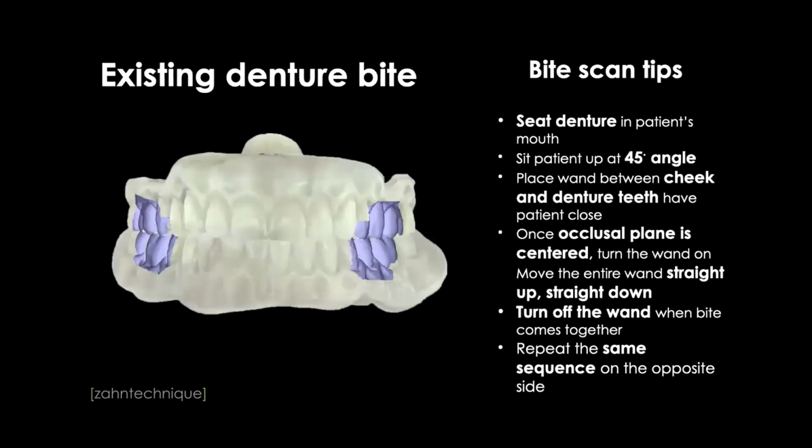So now, if you have a double arch denture, we can just take a bite and take it out like a sandwich and scan that, right? If you have just one arch, we put it in the mouth, let the patient bite and scan the bite in the mouth. So we have basically a bite to the real opposing, right? So that's like the choices you can do. Same with the bite block, right? We take a bite basically, and we have to scan the bite. That allows you not sending us the actual records physically to the lab. We just can send us the scans.